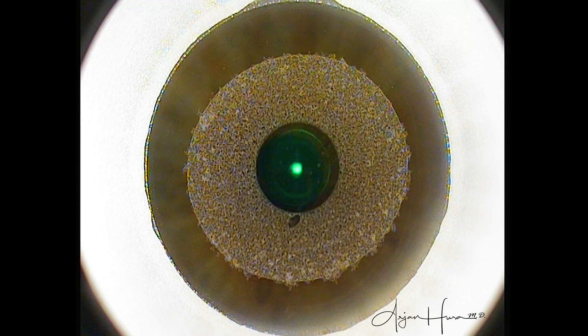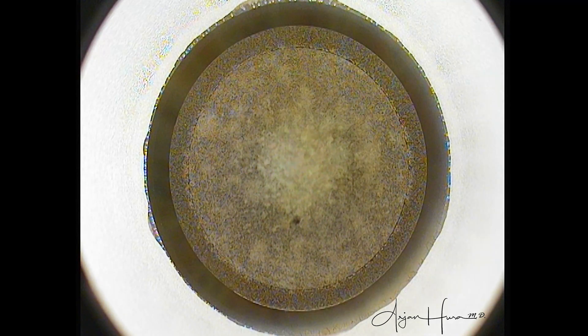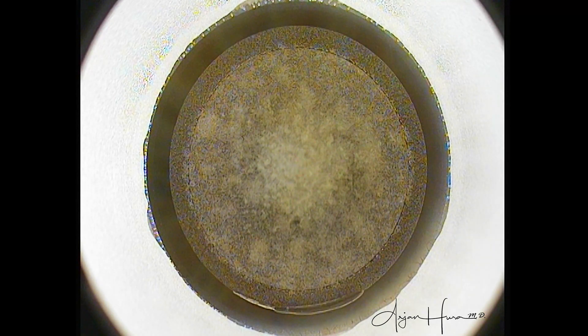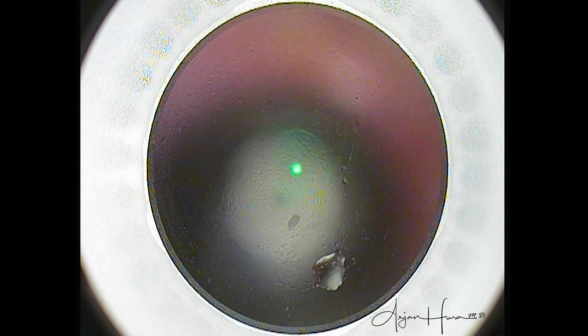Again the outside-in refractive cut. And here you can see just superior to the pupil, this dark spot — sometimes called a black spot or black artifact — is indicative of meibum between the applanating glass cone and the cornea, dry epithelium, or low energy settings on the laser. As long as the black spots are not in the middle of the patient's visual axis, they will likely be of no consequence to the final visual outcome. However, if they are central and numerous, it's time to abort the SMILE surgery and convert to LASIK.